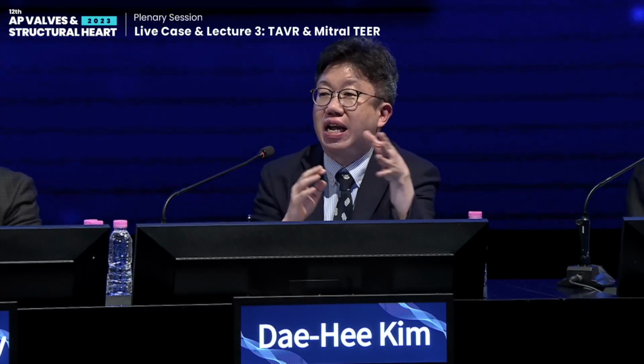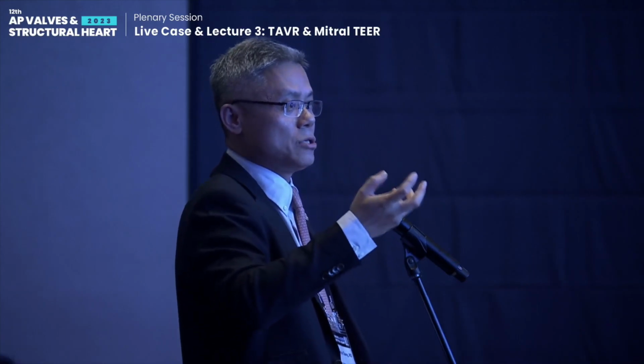Ejection fraction or other echo parameters? I think this result is from the very early experience. The majority of devices used were the first generation, which cannot be retrieved. I think the reason is the high rate of second valve implantation, because the majority used the first generation.